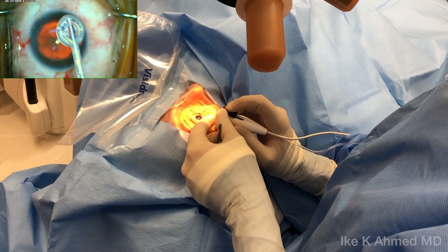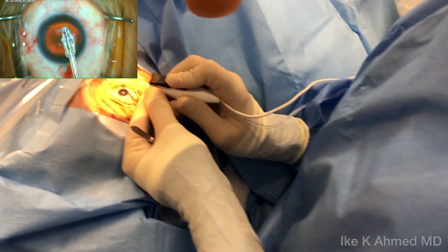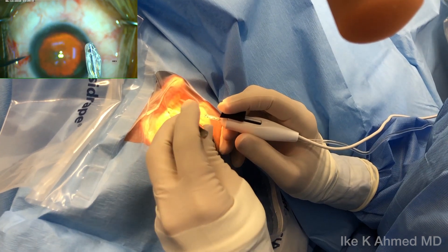Prior to insertion, we're going to slide the slider all the way forward, pushing the pushrod into a forward position, allowing the nitinol ring and the silicone skirt to be collapsed, then examining to ensure we have proper configuration without any debris.